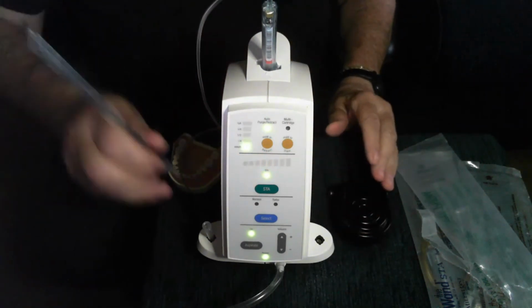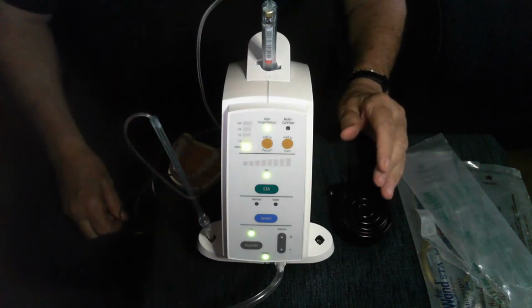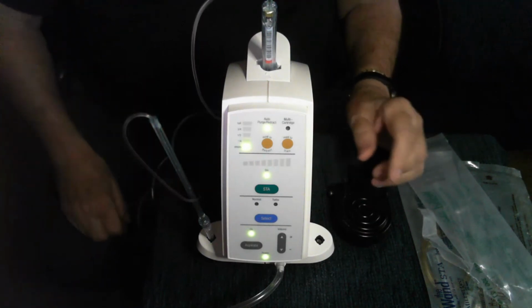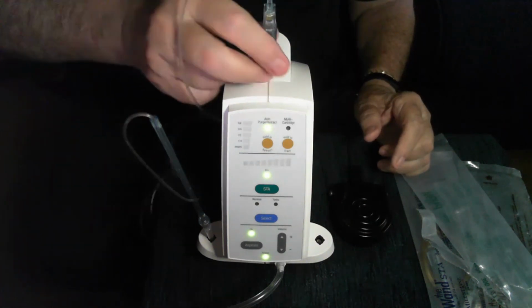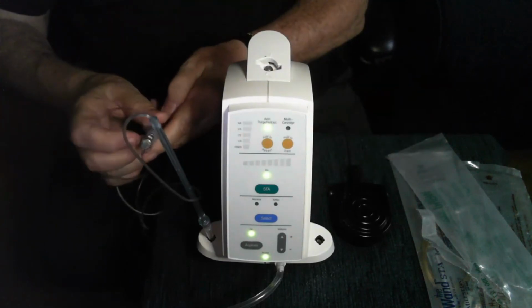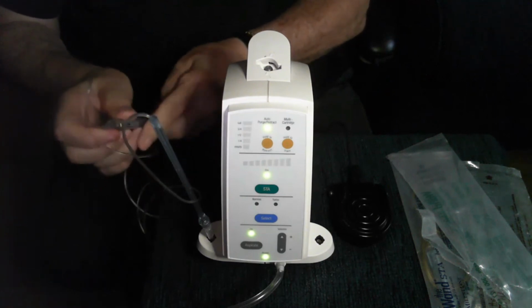There's another feature that I want to explain to you. Let's say you want to give more than 1 cartridge, maybe for a mandibular block or maybe for some other injection. We can have something called multi-cartridge. The plunger will retract. You can take the cartridge out of the instrument, and there are some openings in the cartridge holder that you can use to press the cartridge out.